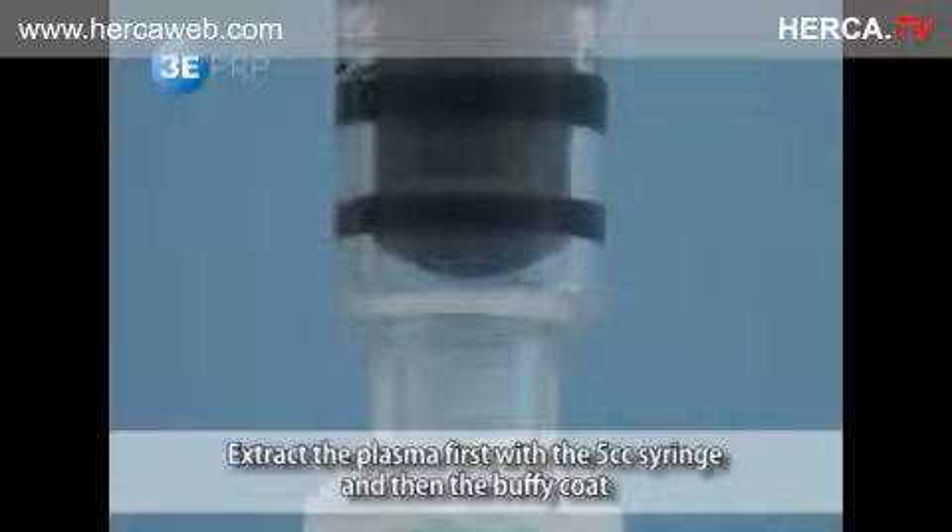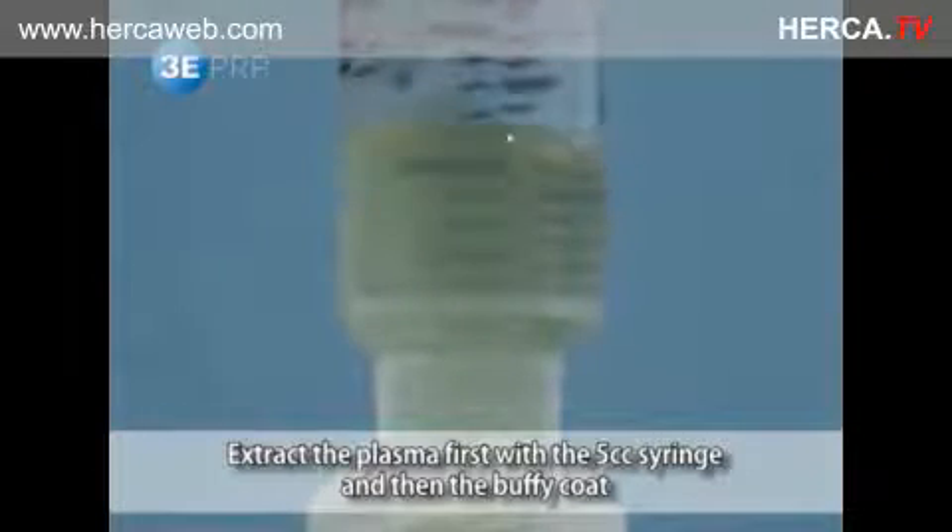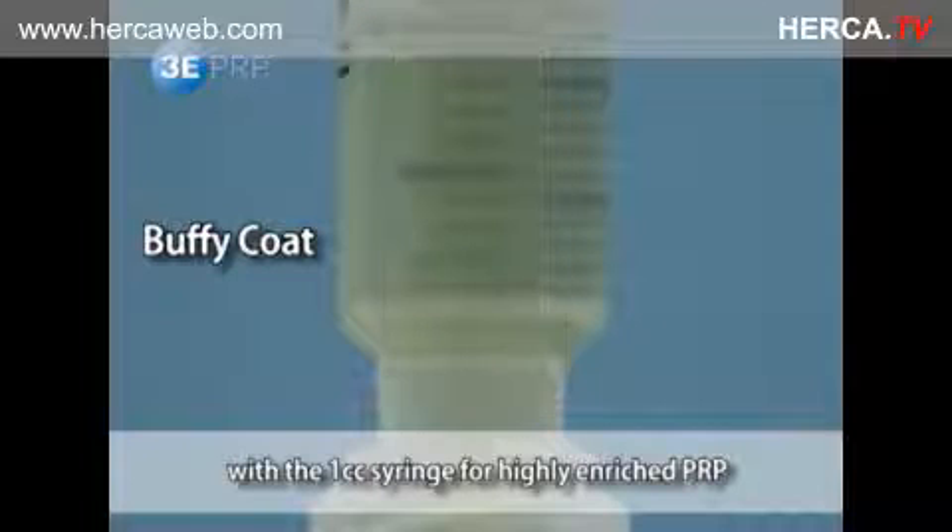When highly enriched PRP is needed, extract the supernatant first with the 5cc syringe, and then extract the buffy coat with the 1cc syringe.